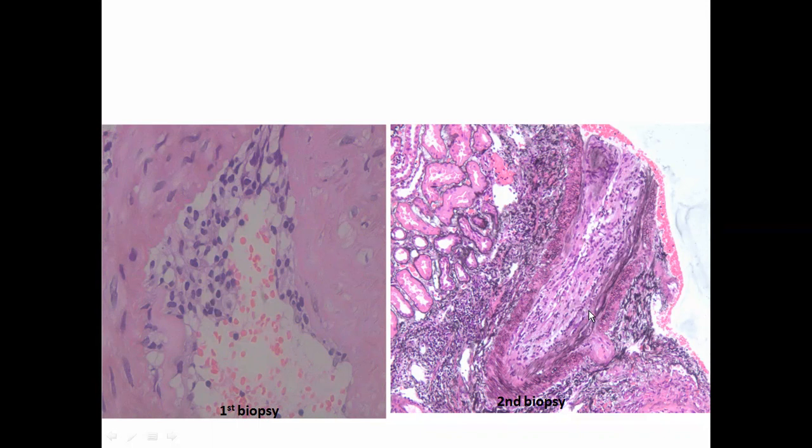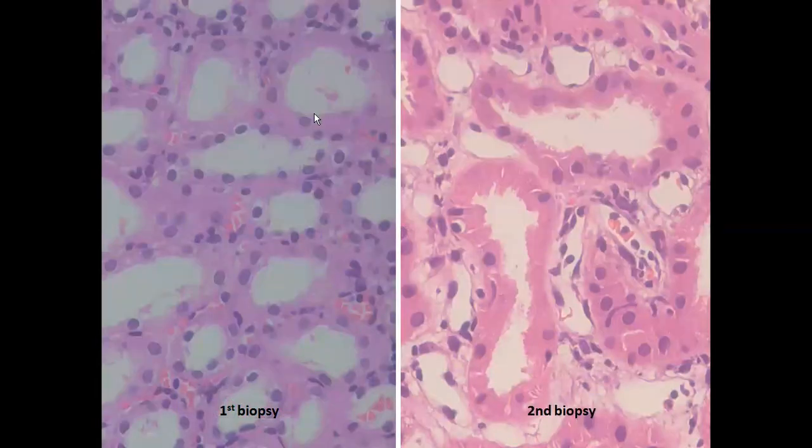You see significant lymphocytic infiltration. And as compared to the previous biopsy, the present biopsy also shows some PTCs which were showing peritubular capillaritis. So there are some PTCs which are empty, which are not showing any cells, but there were some PTCs showing neutrophilic peritubular capillaritis. The ATN, I won't say that there was a significant increase in the intensity of ATN. ATN was towards the milder side.